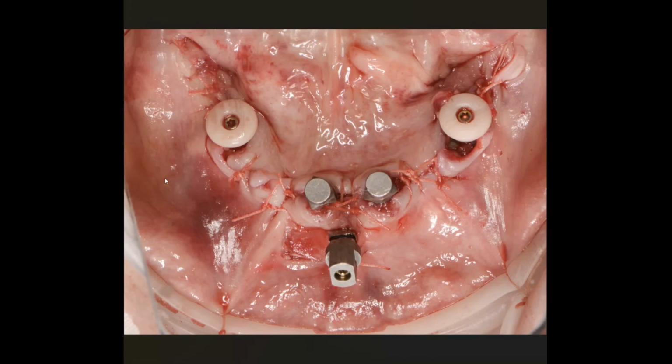They will adapt the bridge to the tissue. And that's the last thing you want to do. You're just using the tissue as a guide roughly for how much pressure do I put on that tissue. So this is not, in my mind, a tissue scan. This is an alignment scan. And you'll notice there are only three pieces that can be aligned here. My midline fiducial and whatever you're putting on 23 and 26.